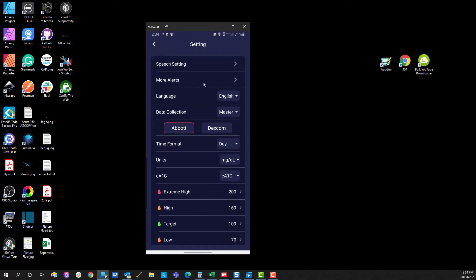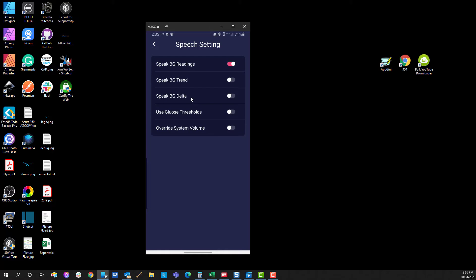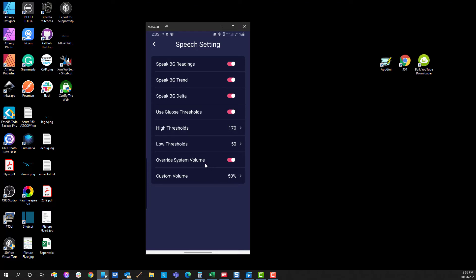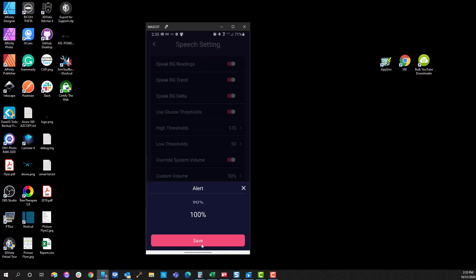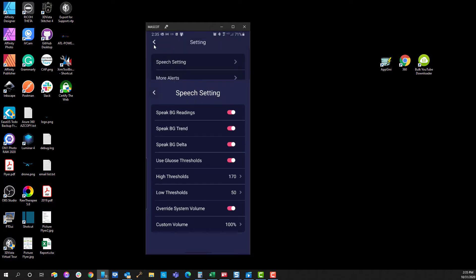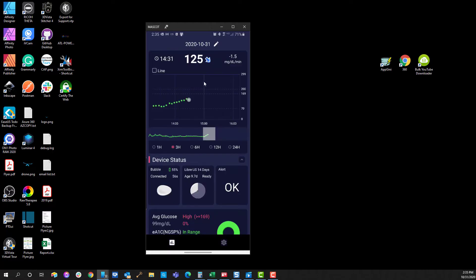Some of the other things in here are really interesting. Speech settings: if you're a senior citizen or your patient is a senior citizen, you may want to enable this because that will keep them from having to look at the phone. It will tell them what the trend is, what the Delta is. It can use the glucose thresholds and system information. We can override the system volume so that if the volume is too low, we can change this to be a hundred percent of whatever the system volume is to make sure that it's loud enough to be heard. What this will do is it'll read the glucose reading. It's a little bit annoying because the sensor reads automatically every five minutes. Within the next five minutes we should hear Diabox and our bubble device speak to us and tell us what our glucose measurement is, what our trend and Delta is as well.